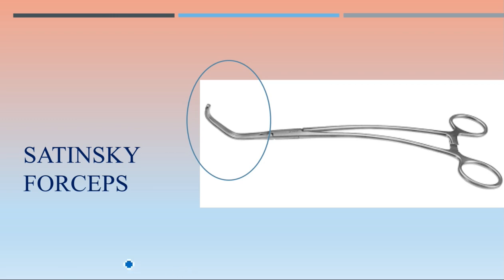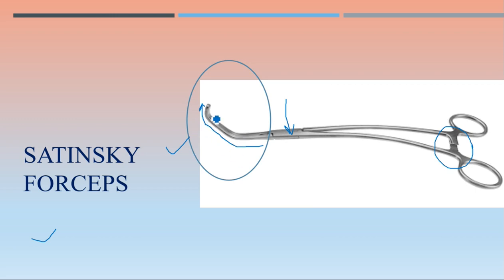The next instrument is Satinsky forceps. Focus on the distal end — you can see the presence of lock, the joint, and the characteristic curvature: one turn, then another curvature, and then another. These double-curved forceps are known as Satinsky forceps, used for vascular surgery and can also be used as a vascular clamp.